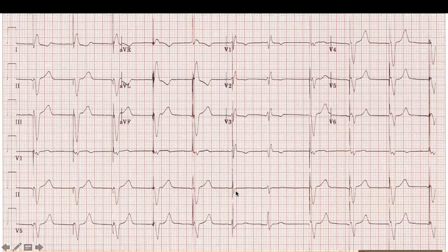So what is this? Okay, we'll move to the next beat. Here there is no pacing spike. So what is this? Normal QRS, so this is the intrinsic QRS, or an intrinsic ventricular beat with a right bundle branch block morphology. This one looks like this one, right? Yes.